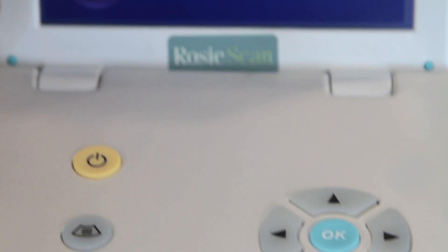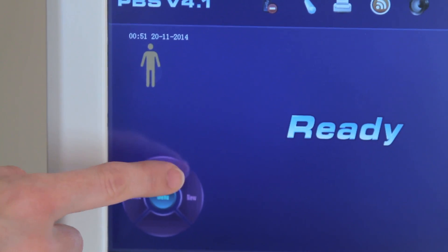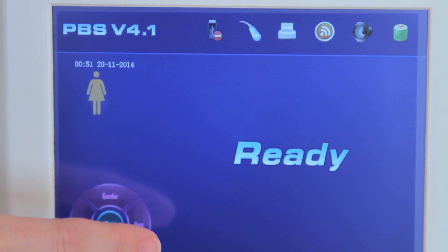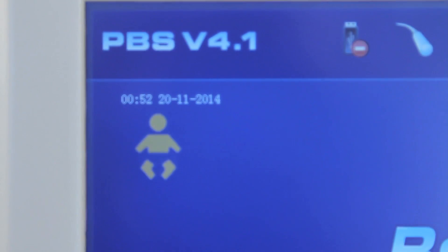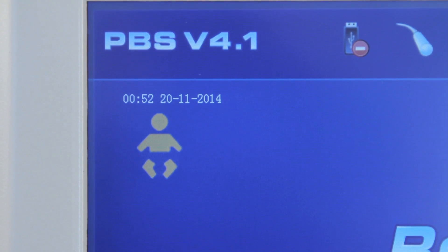Press the up directional key or touch the Gender functional key to select gender. Select the Male icon for Male, the Female icon for Female, and the Baby icon for Pediatric. Pediatric mode is only effective to measure volumes that are less than 100 ml.